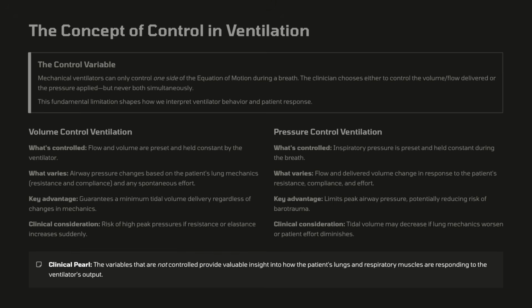Many people think that if I keep in PRVC mode, then I do not need to monitor anything. No, that is a wrong concept. It is a pressure controlled breath. You have to check the tidal volumes that you're achieving, because the ventilator will not go beyond a particular pressure to give the tidal volume.